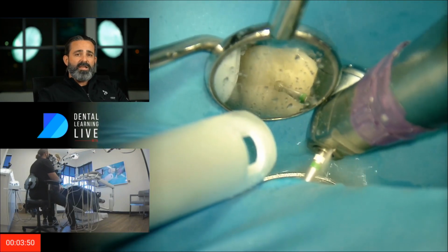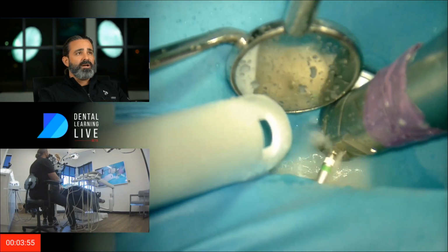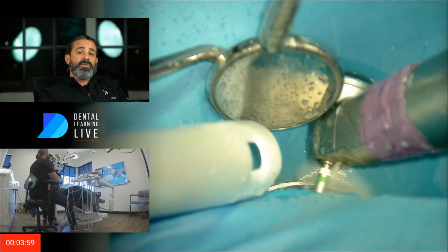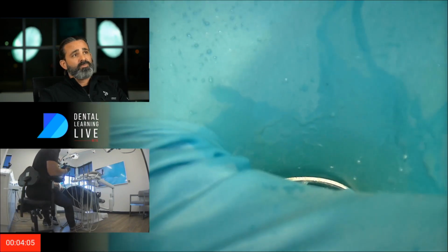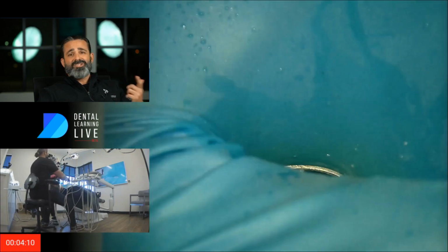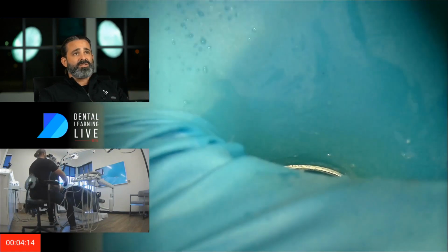The patient clearly had the symptoms, was prescribed antibiotics by her general dentist, and was a 10 out of 10 in pain, but there was no physical swelling present in the vestibule or facial. So that was it: chief complaint, symptoms, and a lesion identified on an x-ray, and it was time to do some business.